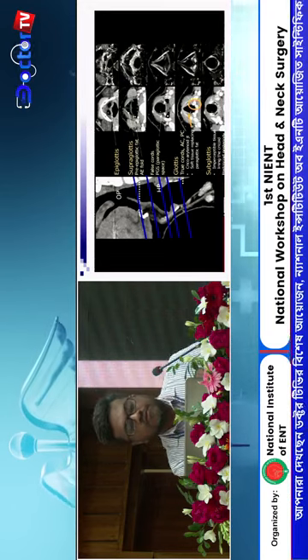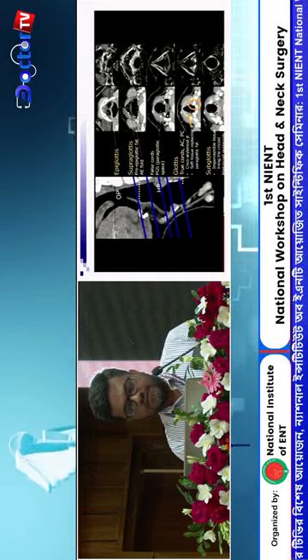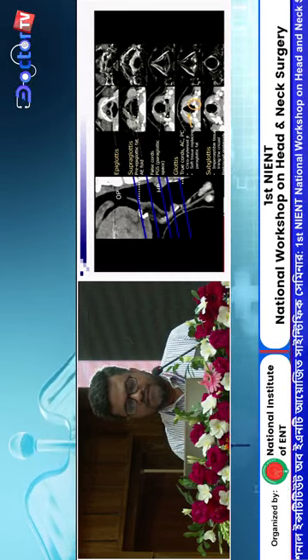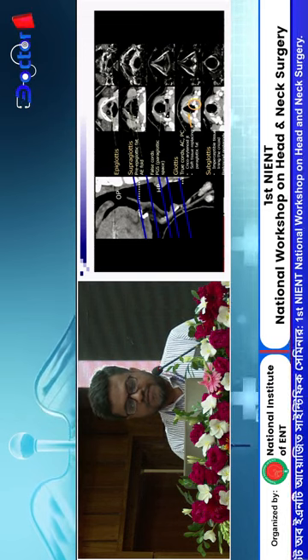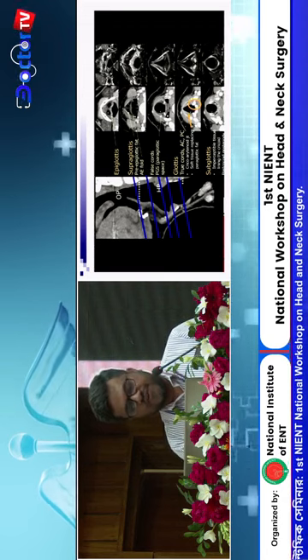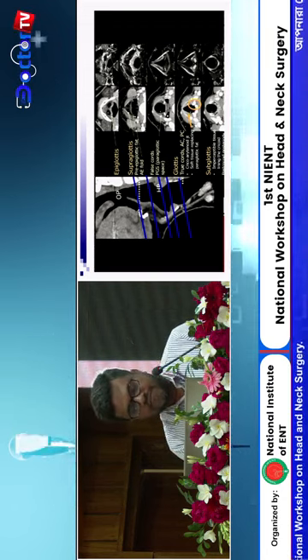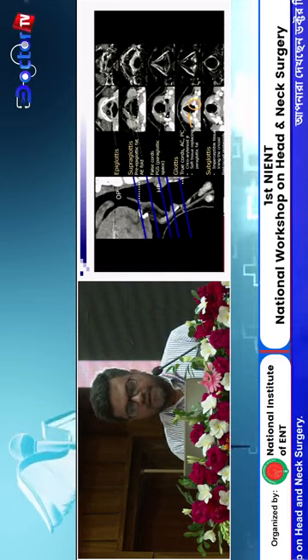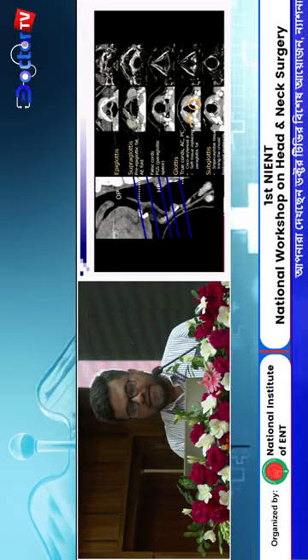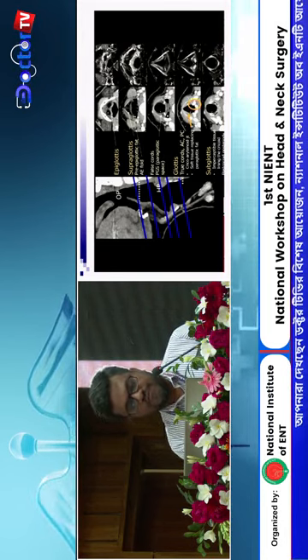Now we go to the level of the middle part of the supraglottis. Here we see the free portion of the epiglottis. There is the fixed portion of the epiglottis, and these are the paraglottic spaces. These are two pyriform sinuses and the posterior pharyngeal wall. Below, the aryepiglottic fold starts to appear. Below this level, at the lower part of the supraglottis, we see the aryepiglottic fold, the paraglottic spaces, and the lower part of the pyriform sinuses.